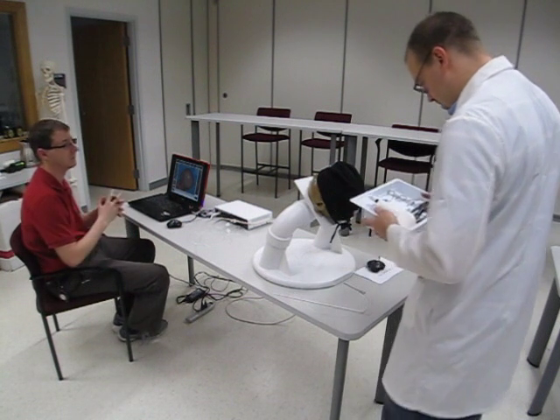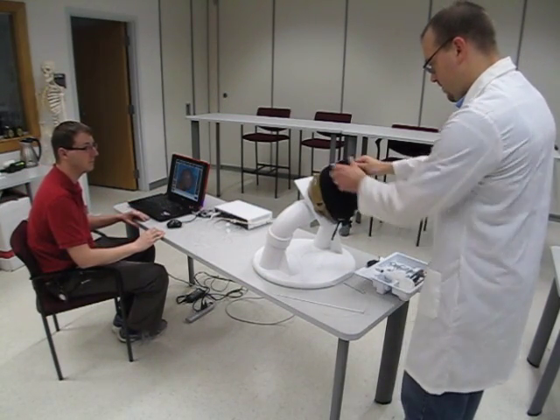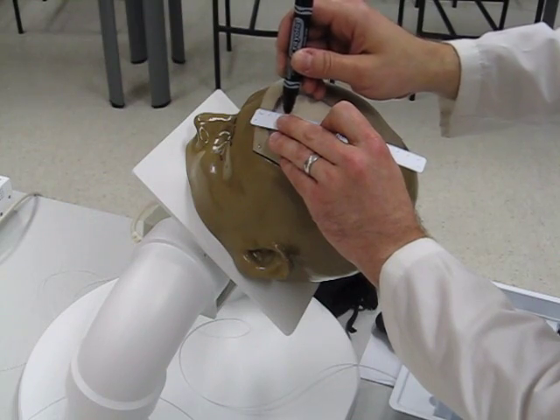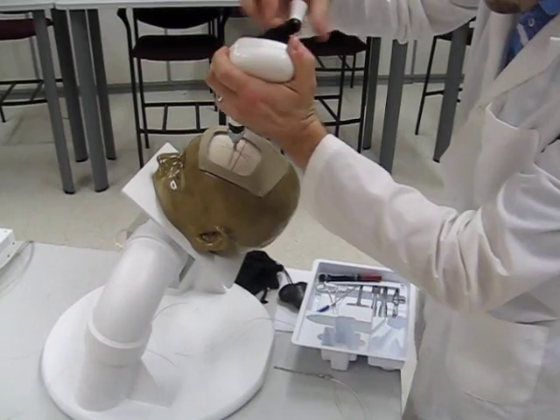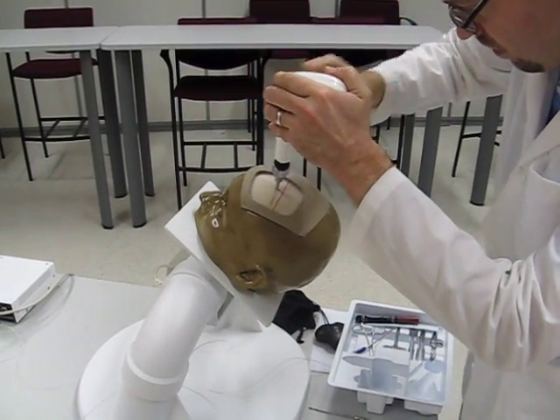If you have not familiarized yourself with the tools in your kit, do so before you remove the drape. Completion time is a factor in scoring, and that time begins when you remove the drape. The patient has been prepped and draped. There is no scalp to cut or suture. You will have to mark and drill the skull and then place the catheter.